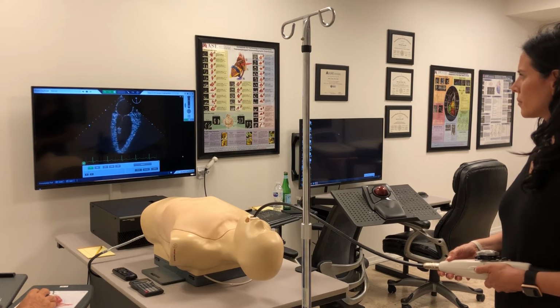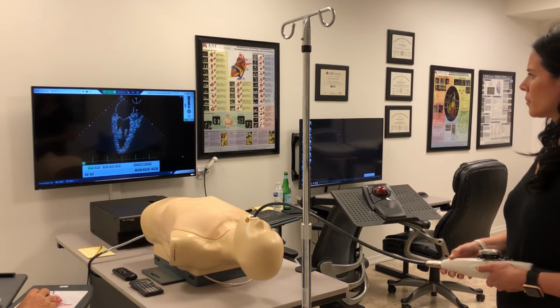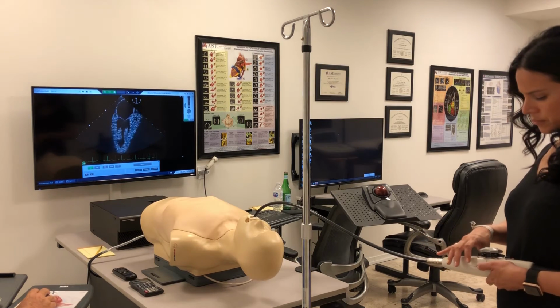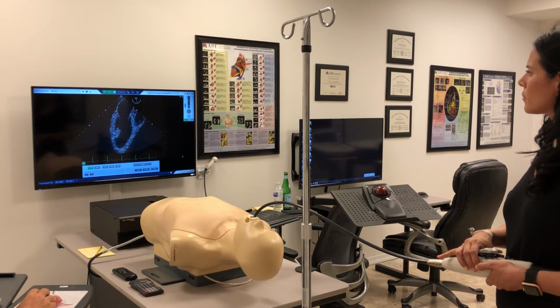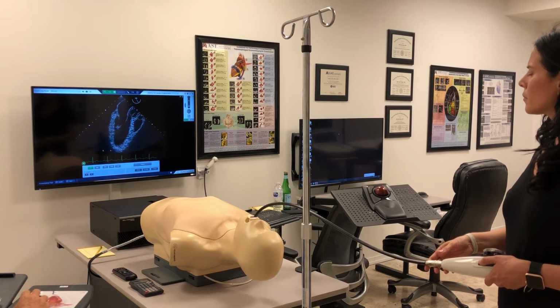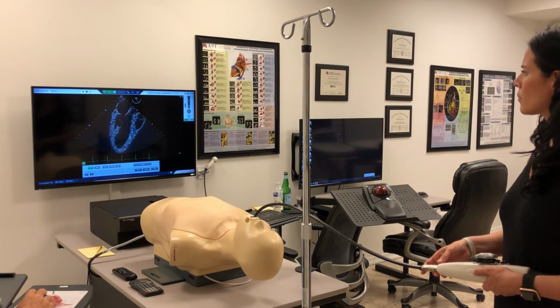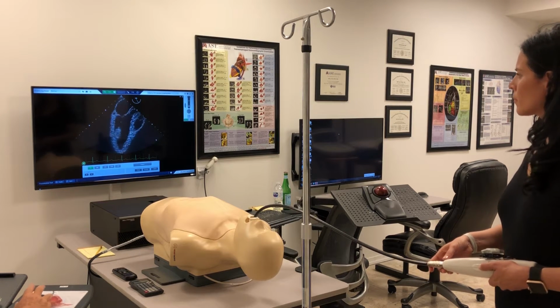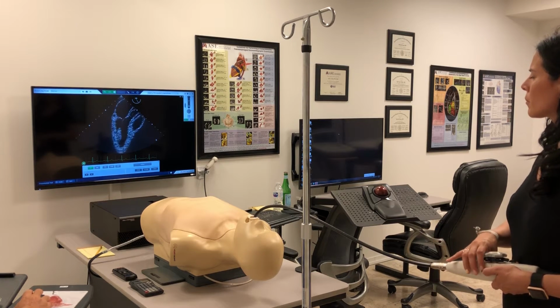Let's go ahead and proceed on to the long axis view, which is simply this view with an additional 30 degrees or so. So let's start at 120. Go right to 120. And then use rotation to make sure that the apex of the heart is non-foreshortened. Good. Then you simply glance up at the aortic valve. If it looks good, you're done. If not, add in another 5 degrees of omniplane.